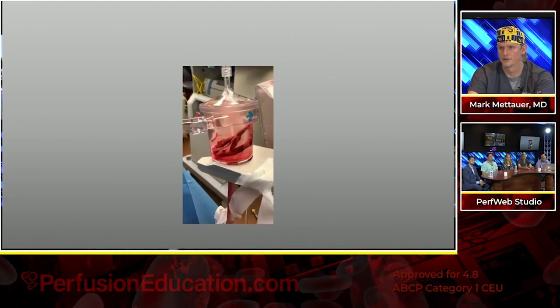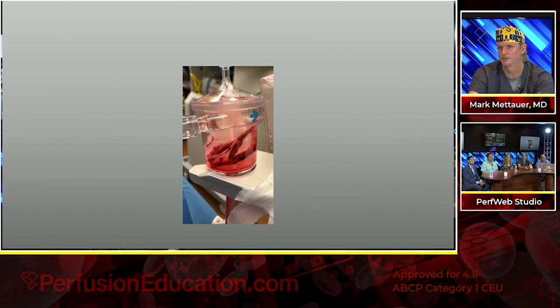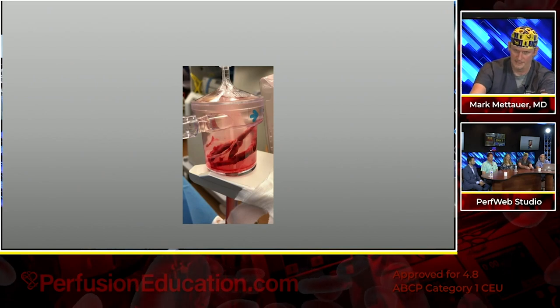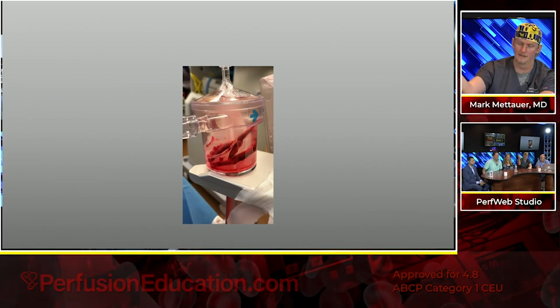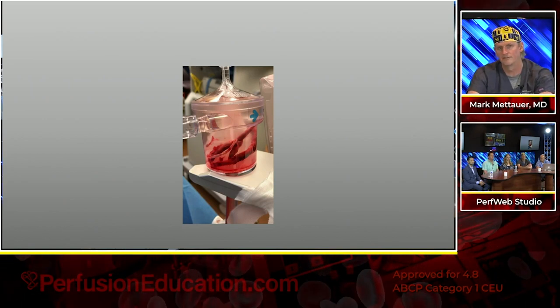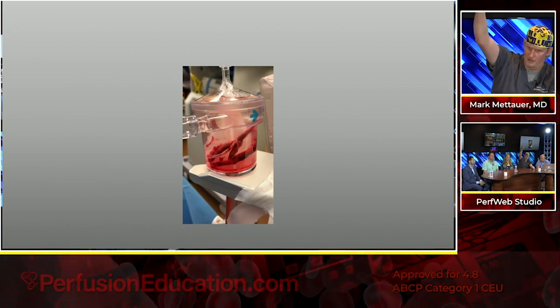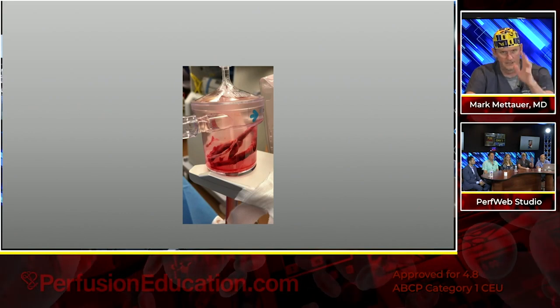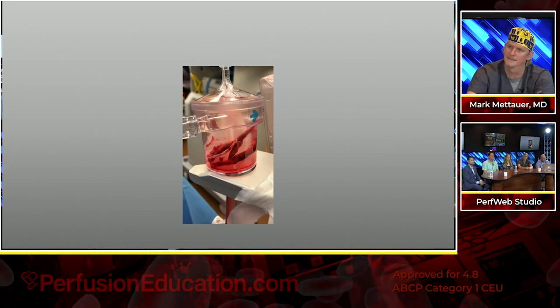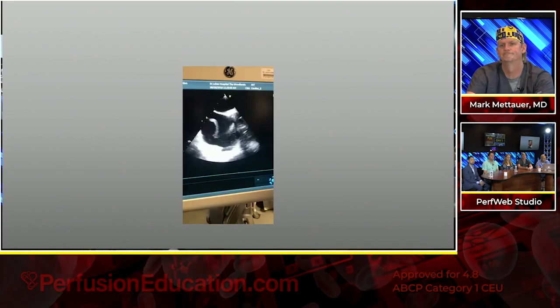When you're finished flushing and returning 95% of the blood back to the patient, again, blood conservation, we don't need to use Cell Saver because we basically return everything back to the patient. When you finish the case, you literally pull the cannula out of the neck, make sure the balloon's inflated in the dry seal sheath itself, and that way you don't have blood loss through the sheath while you're holding it up like a bong and draining it into the pump. Then they return it through the femoral access and flush it, and this part is done on the back table, so you can see the specimen in the filter and remove it.